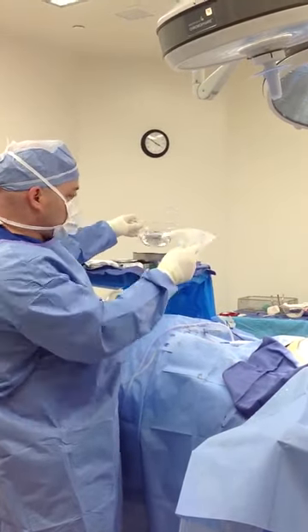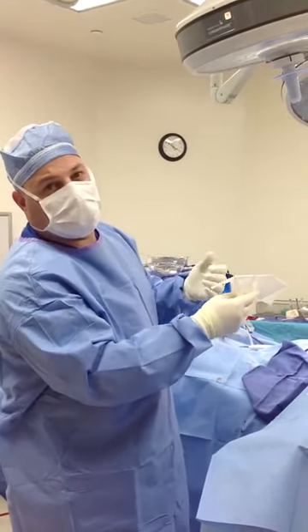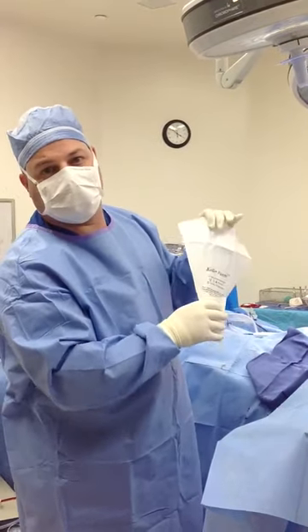What we're going to do is transfer this into this using the no-touch technique. My hand actually doesn't touch the implant, and the implant doesn't get rubbed against the skin, so there's less chance of infection and less trauma to the breast.